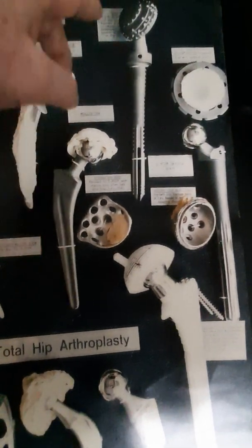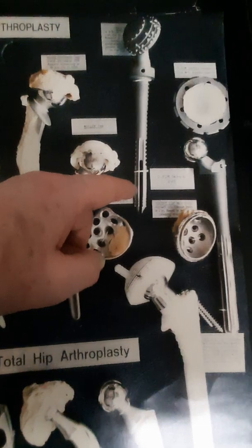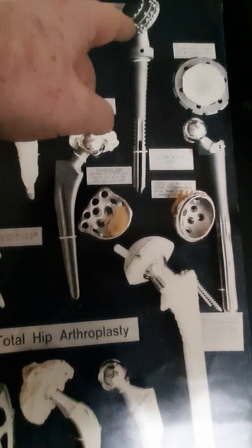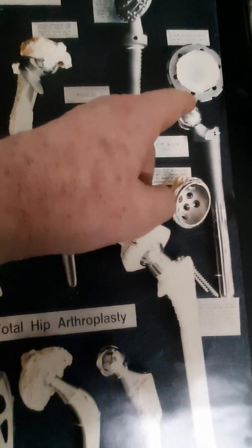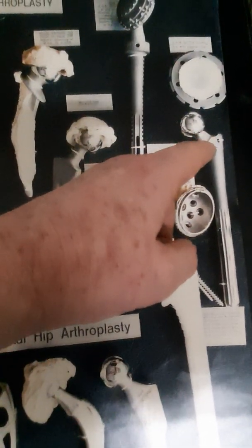Here's an interesting one. This is a Russian type hip replacement. It is non-cemented and it was a constraint. The head and the cup were held together. Here's a modern version, S-ROM. See, plastic insert, you could dial it around different amounts of version. And the long stem, you get different version on that as well for the femoral component.